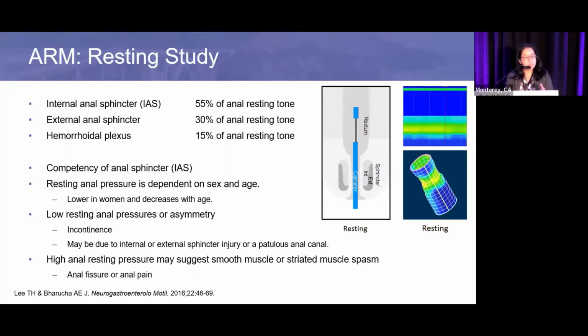Now, during the study, we really look for the competency of the anal sphincter. The resting anal pressure is dependent on sex and age, so it's generally lower in women and decreases with age.